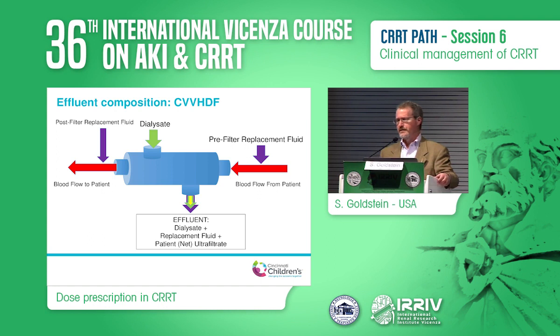Now, why would you use different modalities? In convective clearance, larger molecules are removed more efficiently than with dialysis. In a solely diffusive mode, the clearance is based on the Brownian motion of the molecule, with larger molecules moving slower, so the chance of them moving through the semipermeable membrane is lower, whereas in continuous veno-venous hemofiltration, fluid is pushed through and solute drag will drag those larger molecules at a more efficient rate than just continuous veno-venous hemodialysis. Again, with small solute clearance, the clearances are generally the same across all three of the CRRT modalities that use some form of replacement fluid or dialysis fluid.